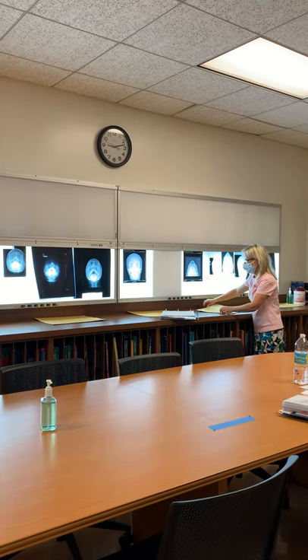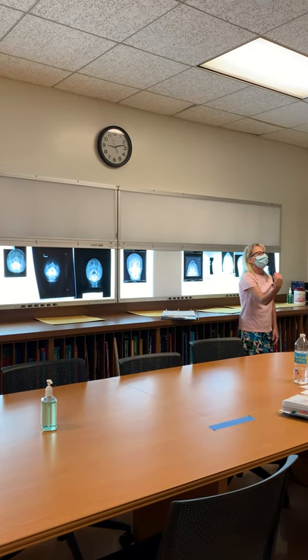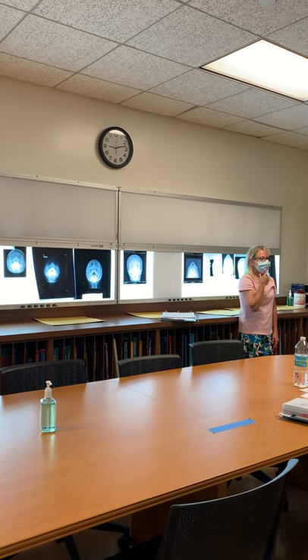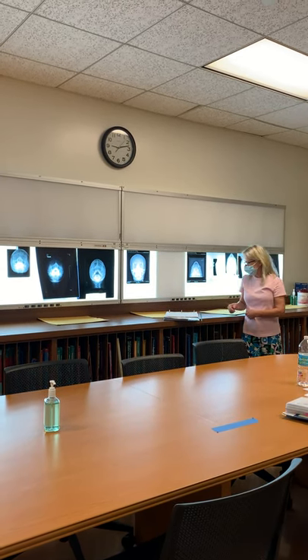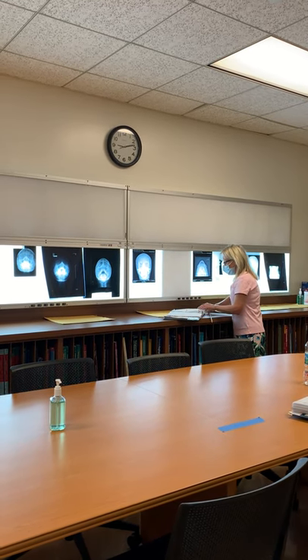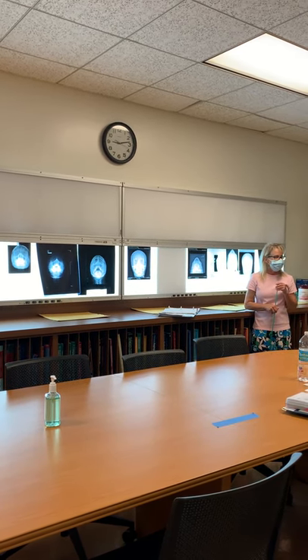Okay? And it's the opposite. If you're AP and you can't get the chin up high enough, you're going to angle the beam cephalad so it runs parallel to the MML. Remember, the MML is from the mentum to the EAM. It goes this way. So you need to know both of those. And also remember that which position would give you magnified orbits? AP.